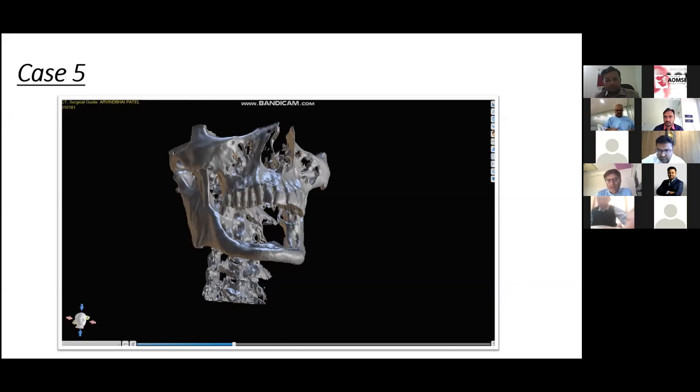So you can close it well, it will heal very well, it will reduce very well. You can debulk the flap. We can place the conventional implants also. You can place the conventional implant. There have been also reports in literature where they have used longer implants, longer cortical implants, drilling through into the fibula and engaging the cortical bone.